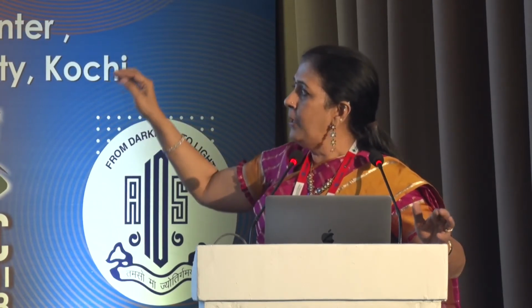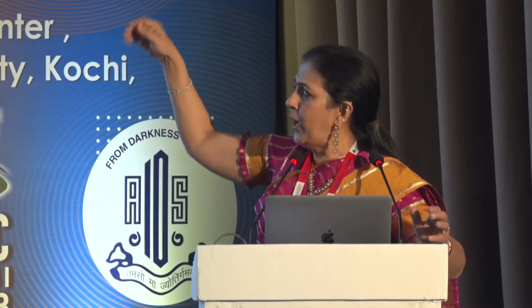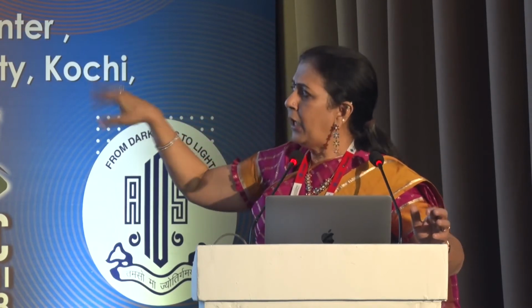This is a case which has a larger area of zonular weakness. As I said, I need to ensure that my rhexis is centered, and keep enough viscoelastic to flatten the capsule. But now, in this case, a CTR alone will not suffice. So I put capsule hooks in that area of zonular weakness. And now I need to have adequate rotation, because there should be no stress on the zonules. Remove the stop and chop, complete the case.